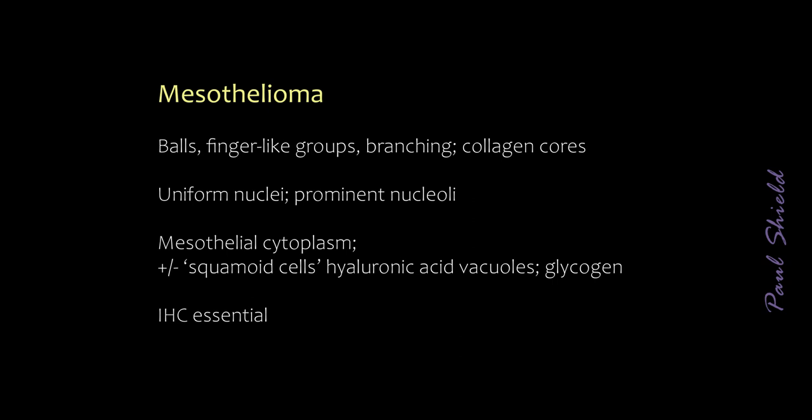Remember, these are well-differentiated tumours mostly, so the nuclei tend to be quite uniform and not show a lot of anisokaryosis. In fact, if you see a lot of variation, size and shape, you need to really start thinking harder and look for more adenocarcinoma features. Although the nuclei are fairly uniform, often they'll have very prominent nucleoli, just like adenocarcinomas, and they can mimic that closely. You will occasionally see large, bizarre malignant cells amongst a very uniform population.